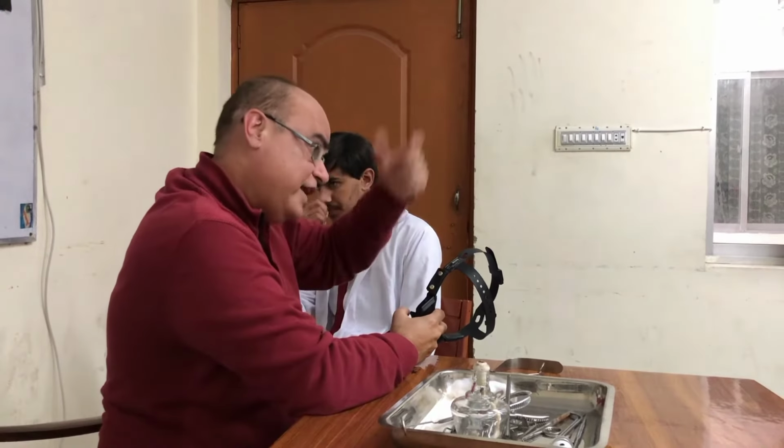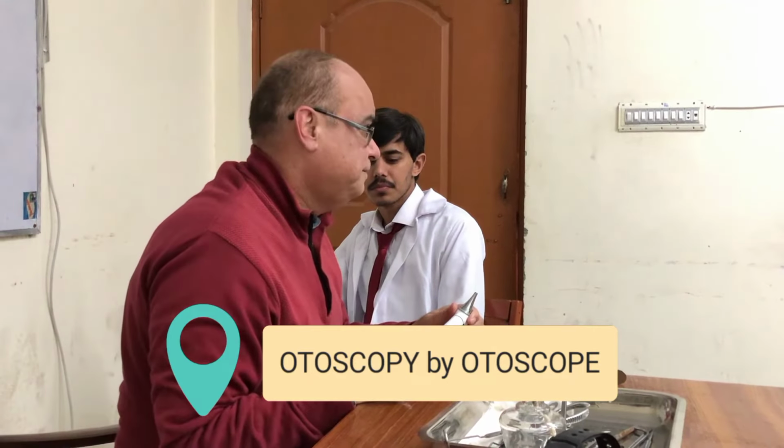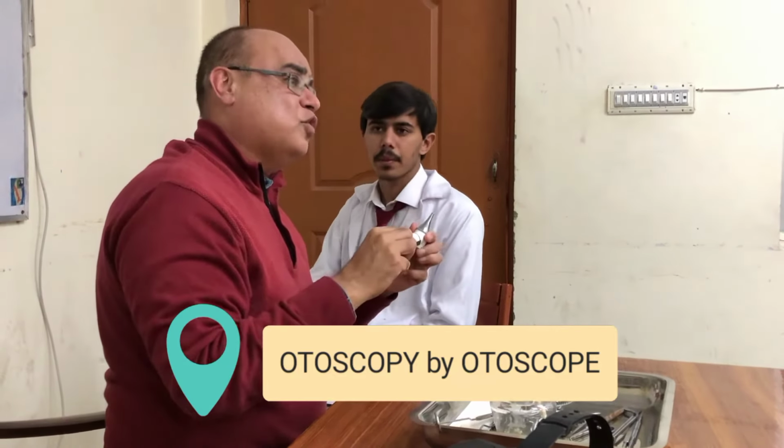For respiration, when the airway is being checked, there is no need for the eyes to be closed. Okay, so after that, just at the start someone said that someone may be having a nasal problem but may be presenting with ear complaints. So we have to check the ear. For the ear, when we do the ear examination, we will go systematically, so many steps will be there. But as a part of nasal examination, straightforward you will go for the otoscope and do the otoscopy. What is the complete procedure, how to hold it, and what we have to look for when we do the ear examination, there I will tell you the details.